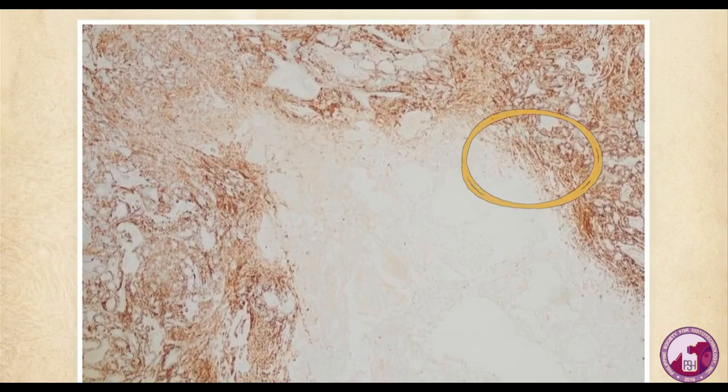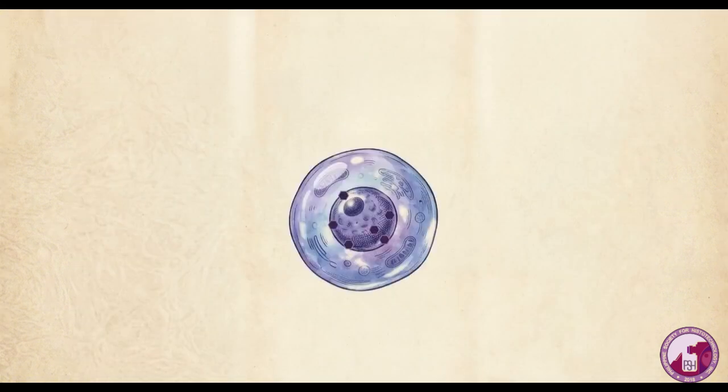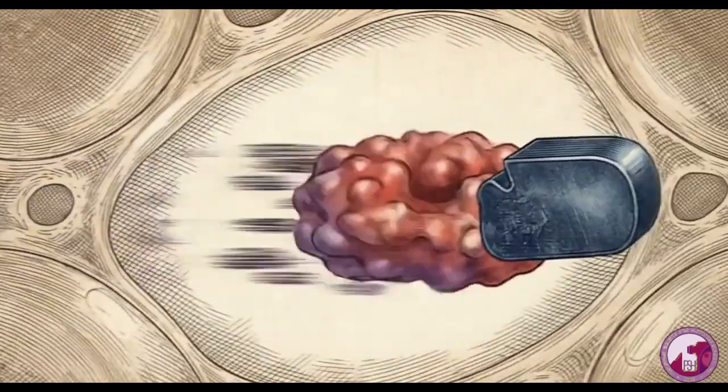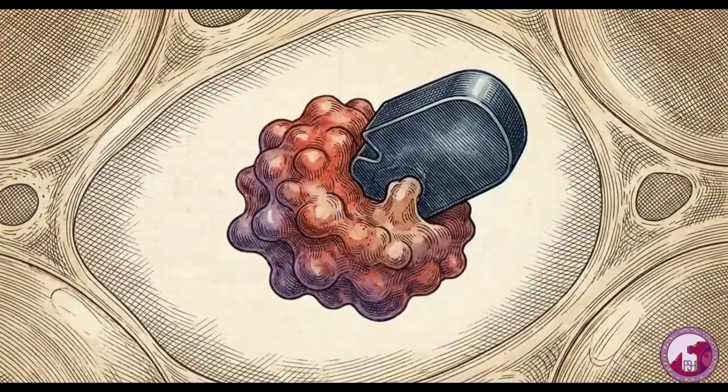Biologically, degenerating or necrotic cells, like the chaotic zones in this specimen, inherently and randomly bind to reagents, flooding the slide with noise. Enzymatically, endogenous peroxidase activity can drive non-immunological binding evenly across the entire slide. The protocol fix for this is simple: ensure endogenous enzyme activity is properly neutralized with inhibitors before detection.